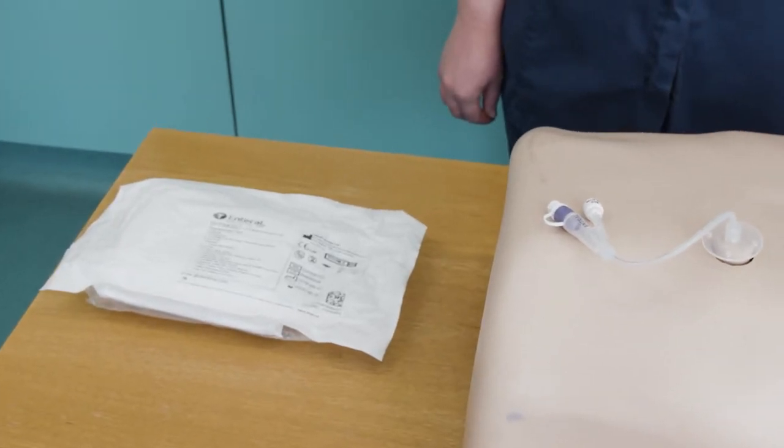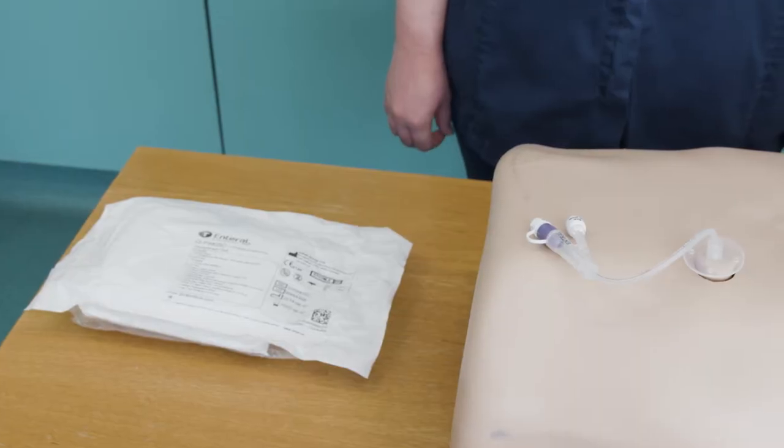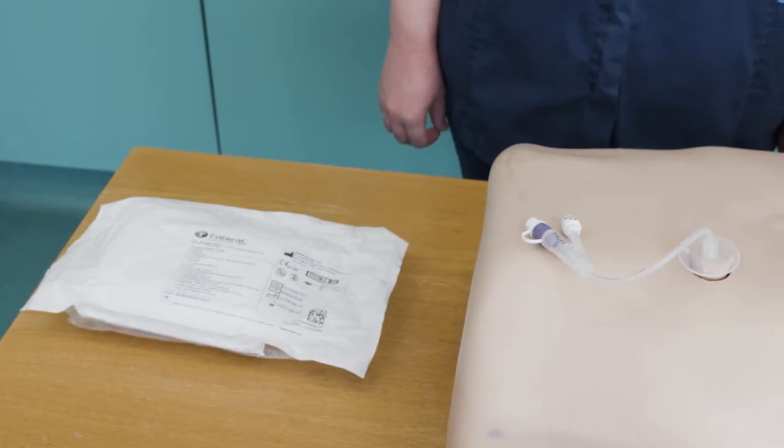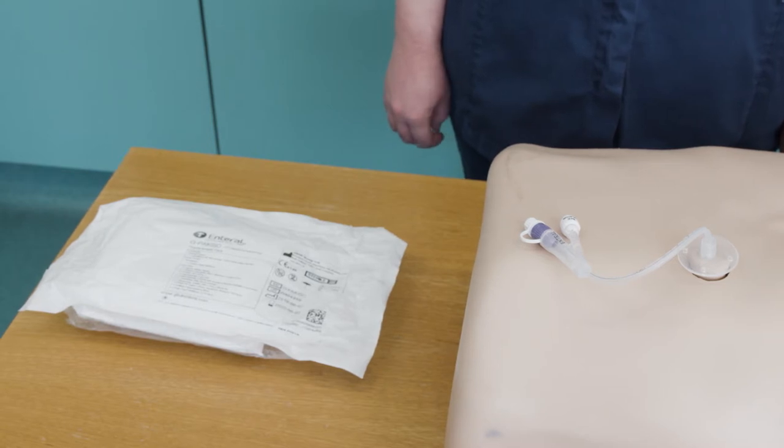Check the patient has been nil by mouth or nil via their tube for at least two hours unless you are replacing the tube because the previous one has fallen out. Check that the patient hasn't taken any medication pre-procedure that may exacerbate bleeding (anticoagulant medication) or affect their pH levels in the stomach, i.e. lansoprazole or omeprazole.